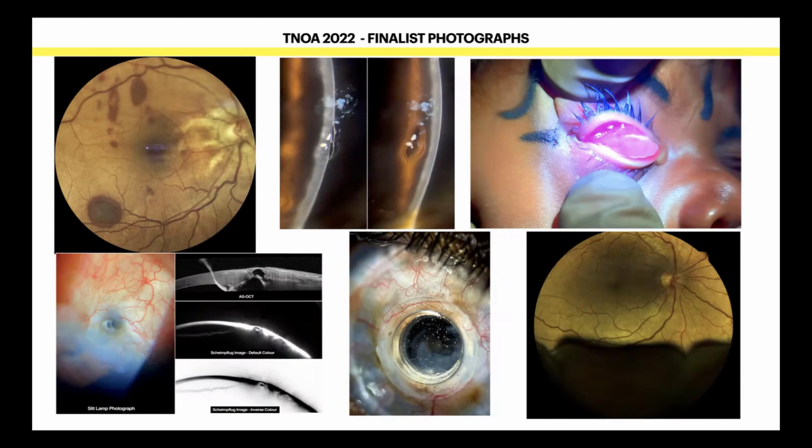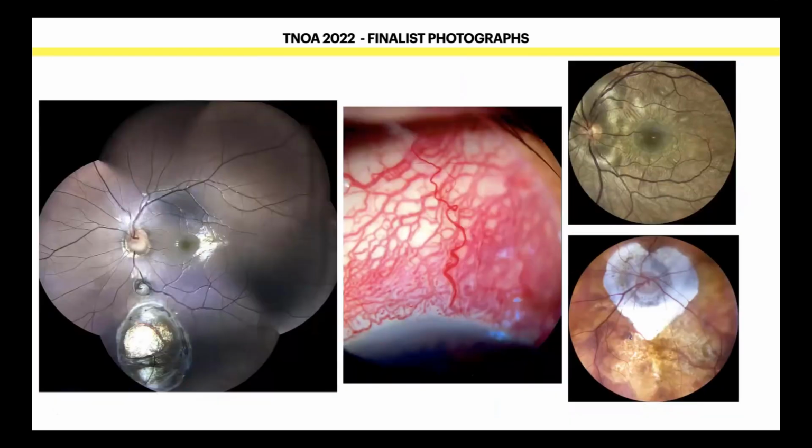So this is the thing, my dear friends. Images are very important for ophthalmologists because they speak a lot. They speak a thousand words. Again, this is one image of a Sturge-Weber patient, where this one solitary vessel alone was very, very prominent. You tell a narrative when you talk in terms of images.